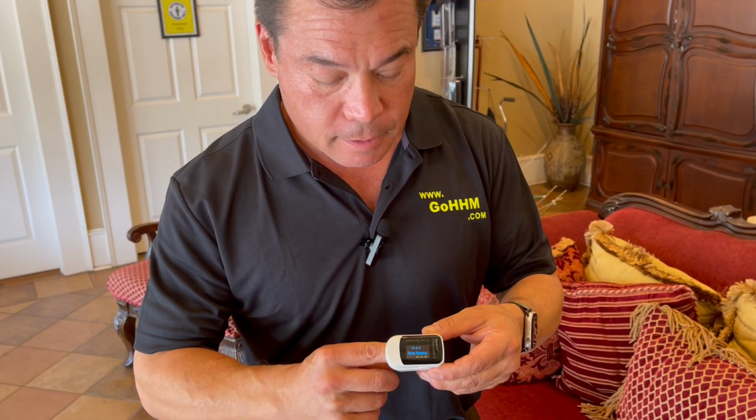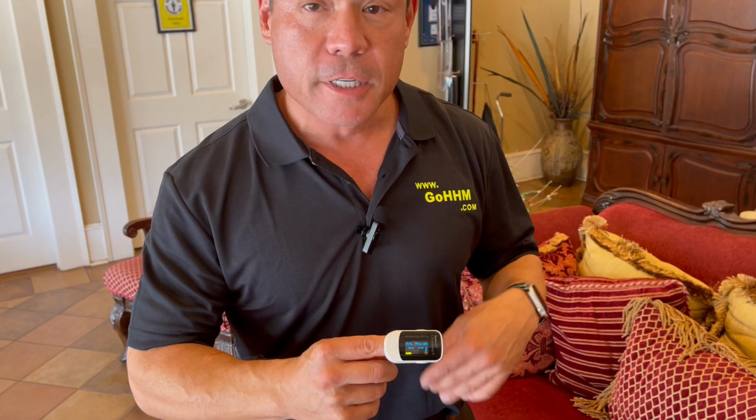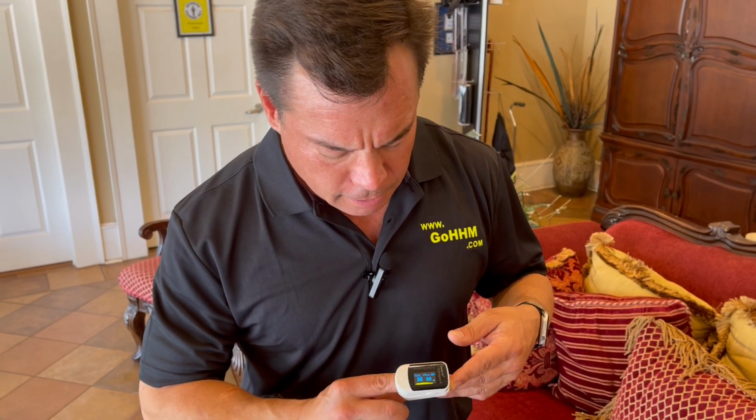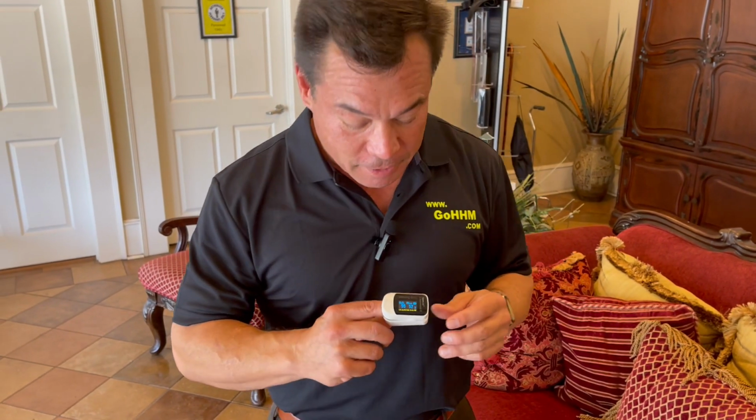Now, to turn this on, you put your finger within like so, and you push the little button. And it's ready to read. This takes a couple seconds because it has to take a reading, but then it does. And look at that. I'm at 98% pulse ox, but it's hot today, so I'm sure that I'm straining just a little bit. My heart rate's a little bit fast. It's because you guys make me nervous.